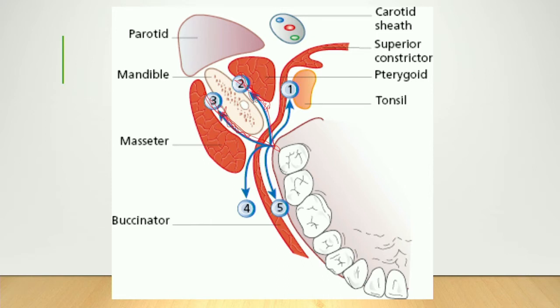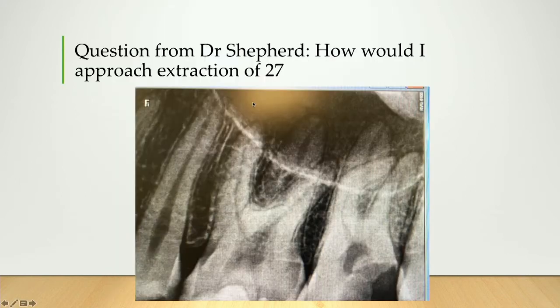Shepherd. Are luxators dangerous in that situation? Good question. So in this situation, I use quite fine luxators. There's no point using, so if this is a one-to-one picture, you have luxators that are about, say, 4 or 5 millimeters in diameter. That would be too large in this situation. Okay, that wouldn't be a helpful instrument. You need something maybe 2 or 3, a very small luxator, very fine luxator.